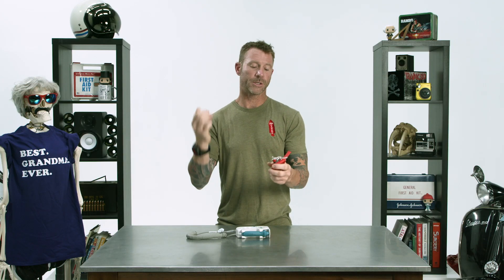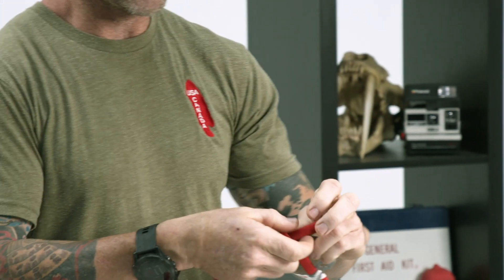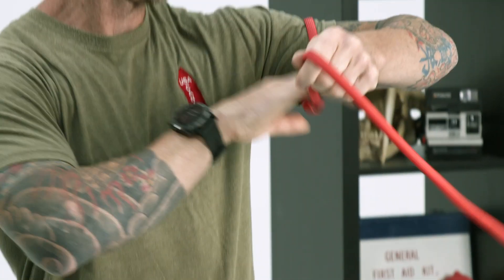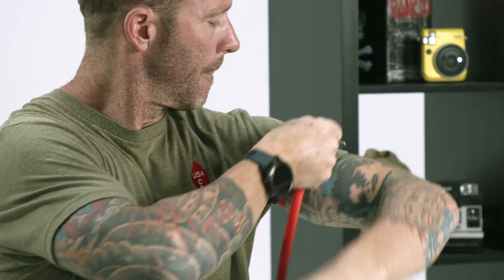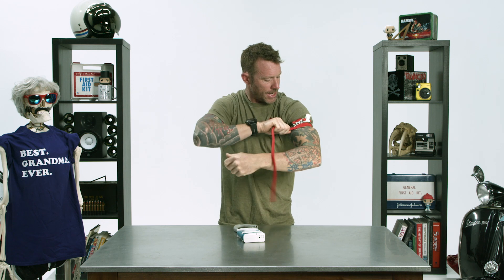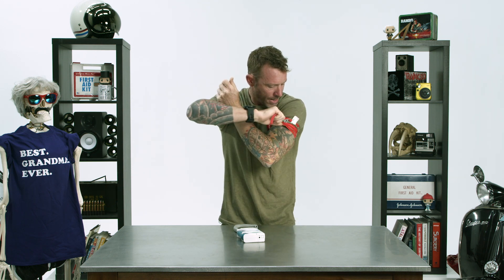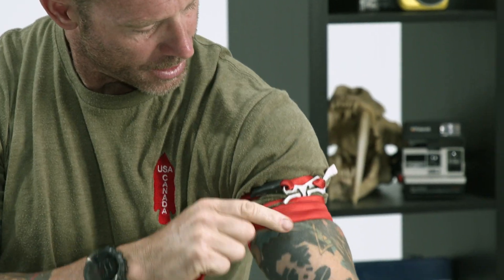So without any further ado, let's go ahead and put this on and I'll show you if it does work. With the rapid, you take the tail, put it through the small loop, making a big loop. I'm doing three wraps, stacking them side by side to get that nice wide band right here.